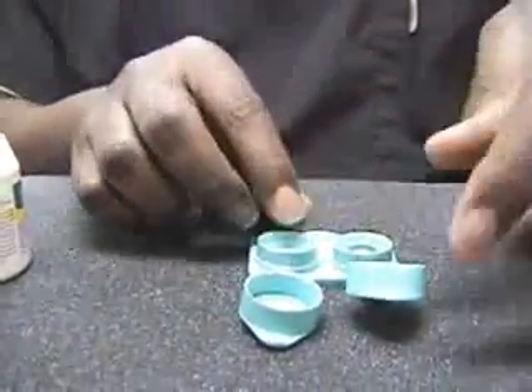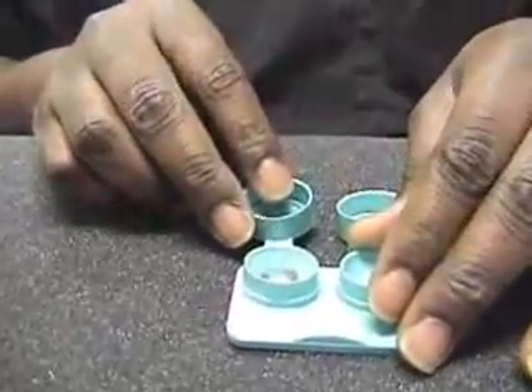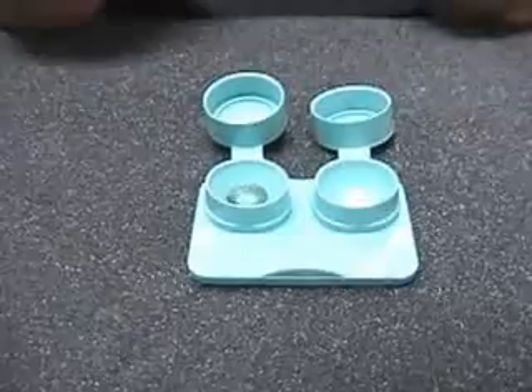When you get ready to close it, you can actually pinch the contact lens, but just make sure that the contact lens will float to the bottom. Make sure that you fill it up with clean solution at all times, and that's how you do it, just like that.